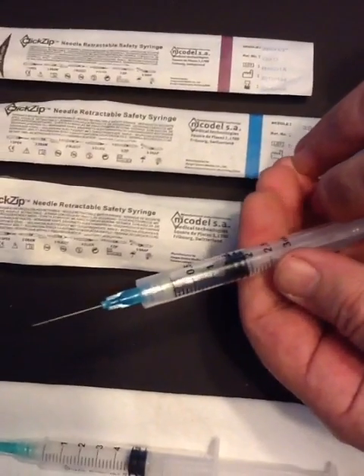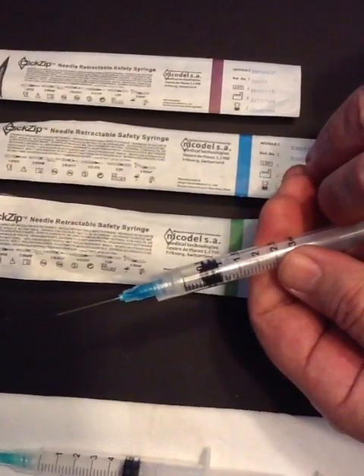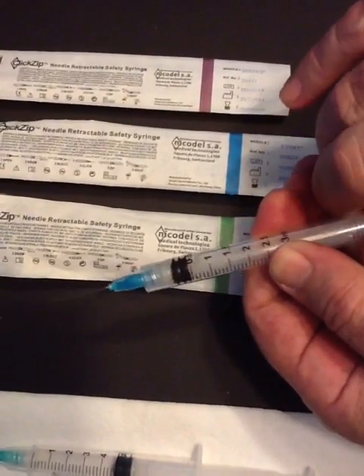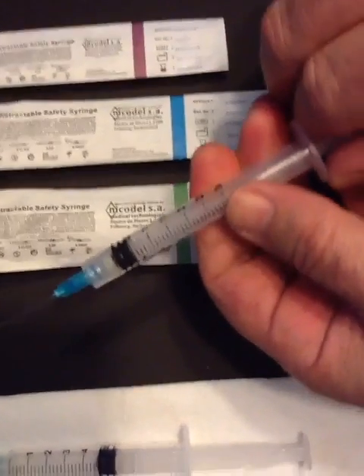When you have done this, start the injection. Push the plunger to the end. You can hear the click — that is the locking mechanism.